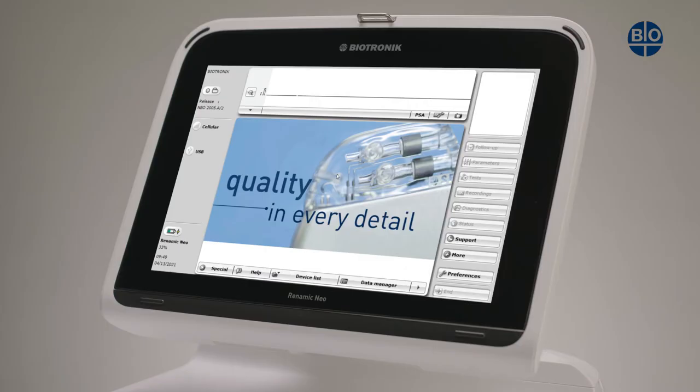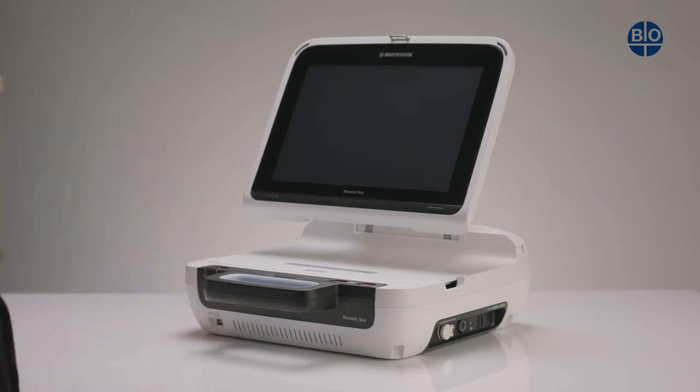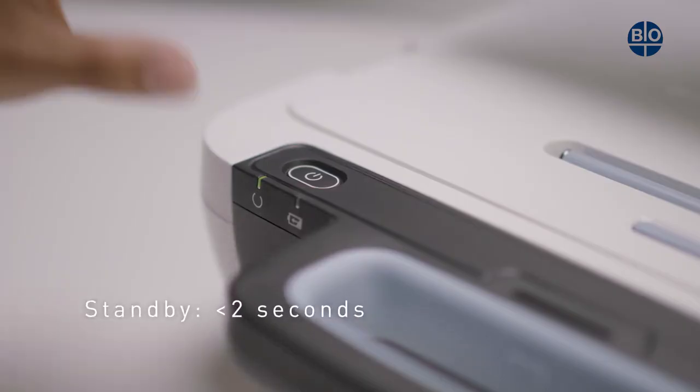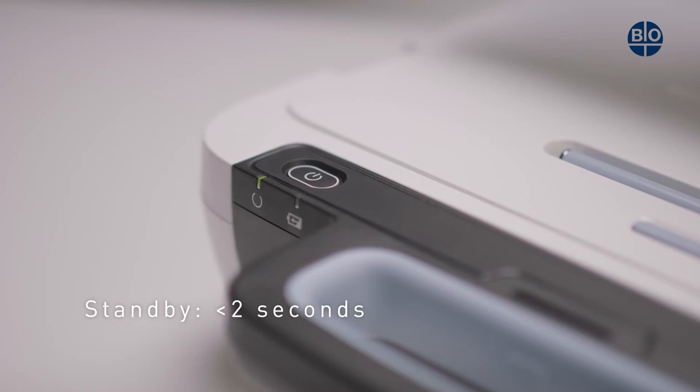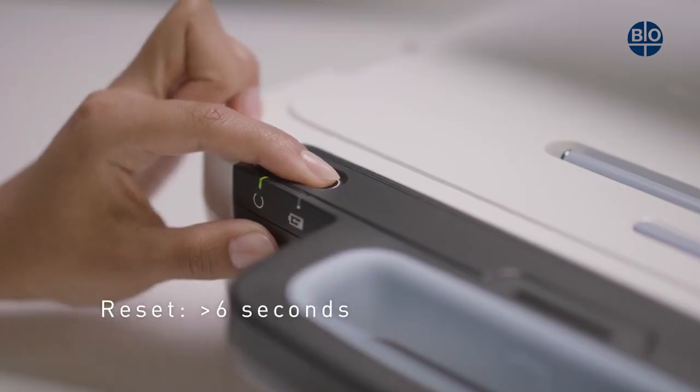This will bring an option to shut down on screen. To put the device into standby mode, press the power button for less than two seconds. The device can also be put into standby by selecting the on-screen option when the shutdown procedure is followed. If you require to reset the device, hold the power button for longer than six seconds.